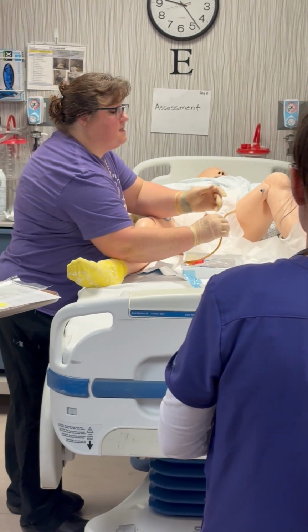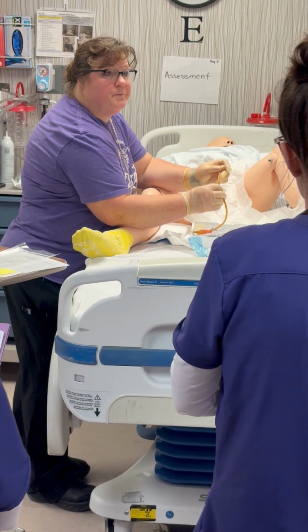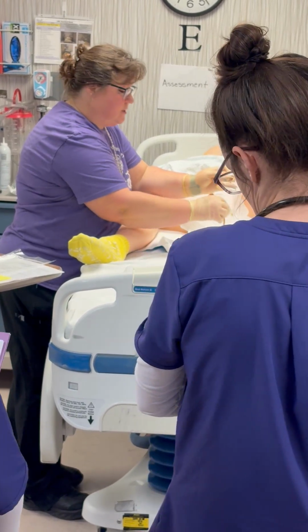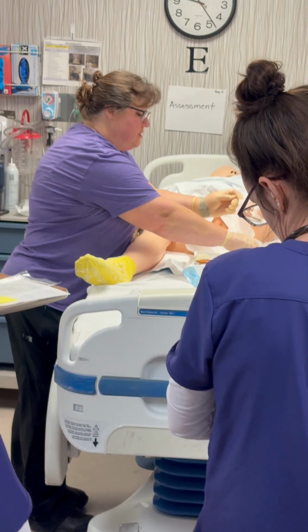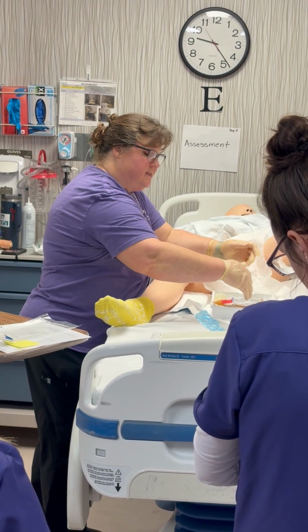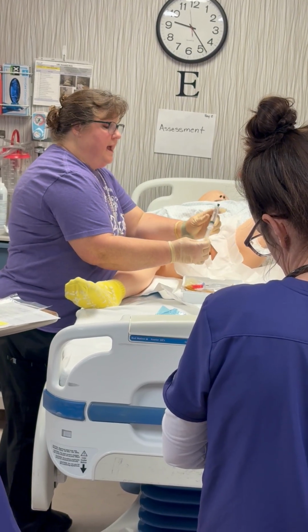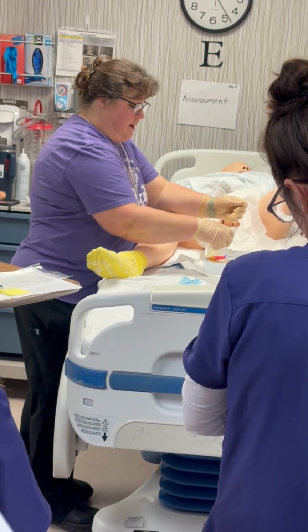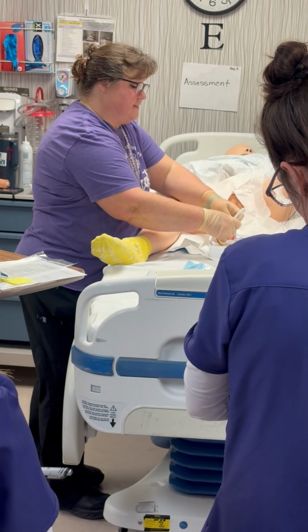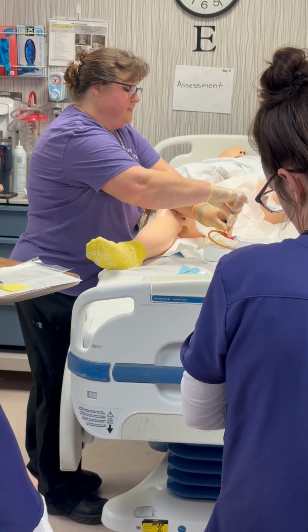And then since this is female, how much do I lubricate this? 1 to 2 inches. So I'm going to put this in my lubrication, 1 to 2 inches, and leave it there. Make sure it doesn't fly out, okay? And then I have my sterile water, and I'm going to put this on there and connect it, okay? Make sure it's tight in there.